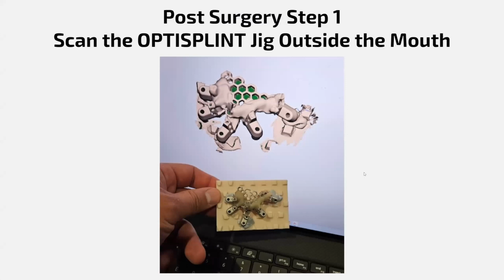Sorry. So, of course, scanning the OptiSplint outside the mouth. In this case, this is not the same case, but it's just an example of how you can use our scan plate to scan the OptiSplint jig outside the mouth, and scan it in a way that is as accurate as possible. A lot of doctors don't necessarily have a desktop scanner in their offices, so having the scan plate available as part of our starter package really makes it a lot easier to scan these jigs outside the mouth and do it relatively accurately.